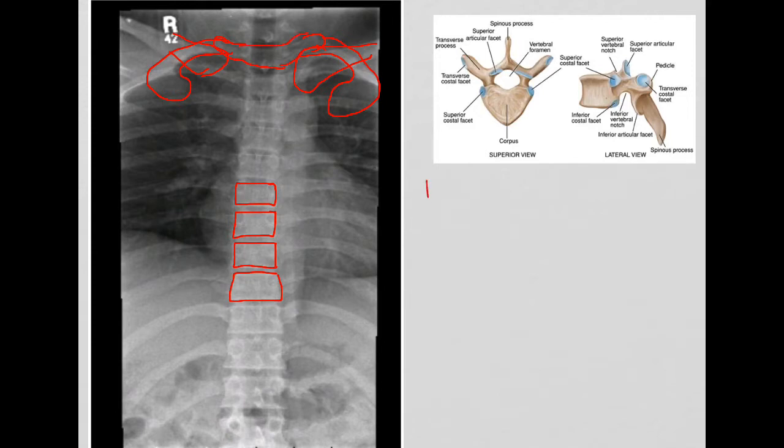Now note that T1, T11, and T12 have direct articulations with their respective thoracic vertebral bodies. So what I'm saying is T1 articulates, or I'm sorry, first rib articulates directly with T1 and T12 articulates directly with the 12th rib and T11 articulates directly with the 11th rib. So this is T1.